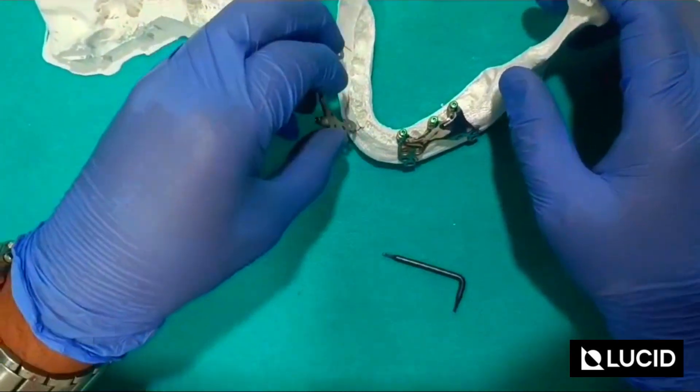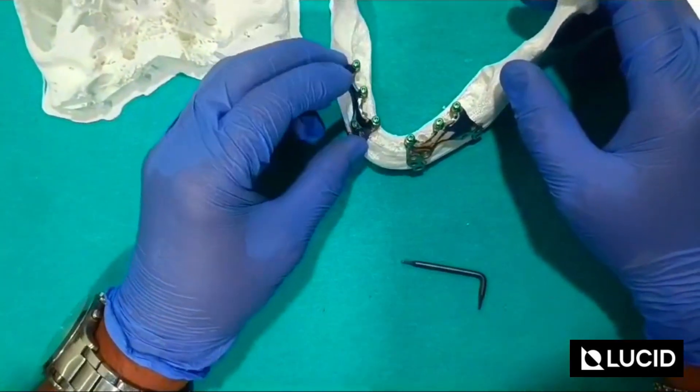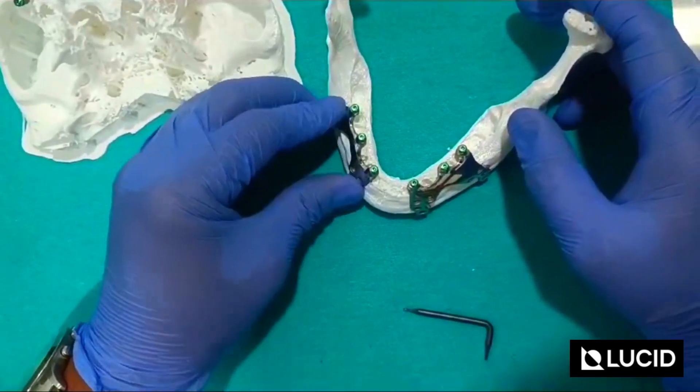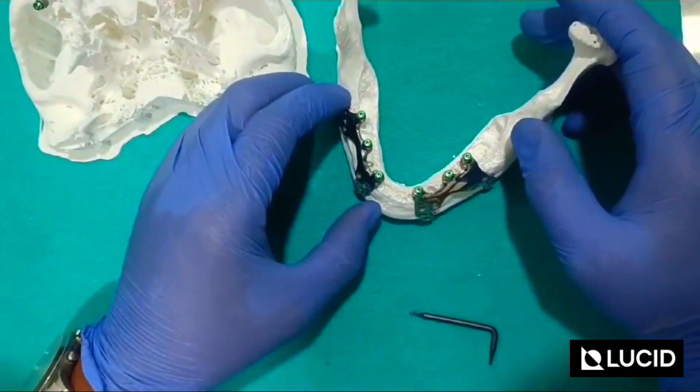All the cover screws are fitted inside. At the time of dental restoration, what you have to do is take out the cover screw, use a multi-unit ostium abutment, and then you can proceed with the dental rehabilitation.